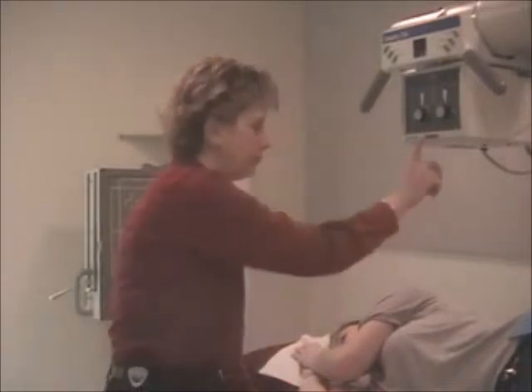Right lateral, tip of the scapula, iliac crest. Divide that halfway and go down 1 inch for sthenic body habitus.